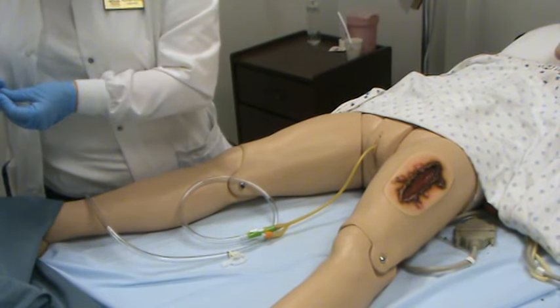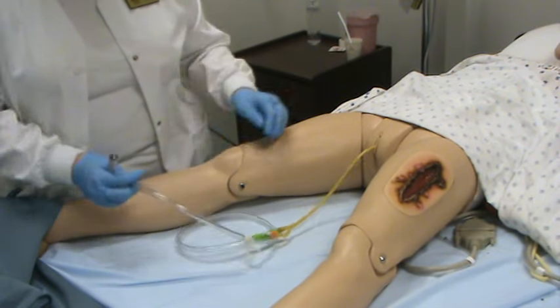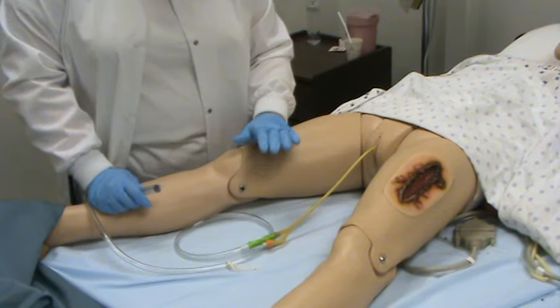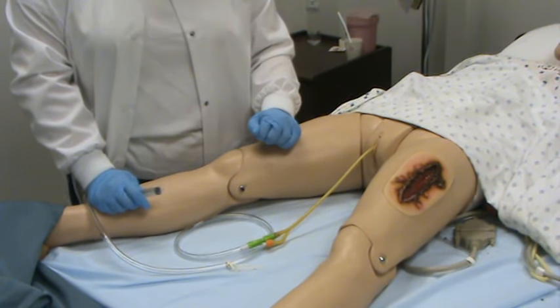The doctor has also ordered this Foley catheter to be removed, so we are going to remove it. Keep your patient covered up as much as you can — they are a little more exposed here just for visual purposes on the camera.